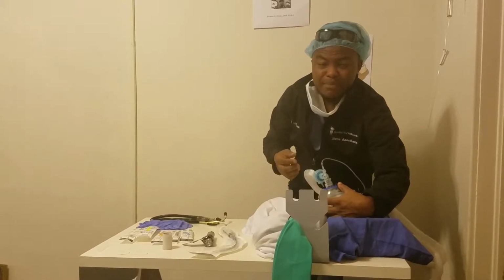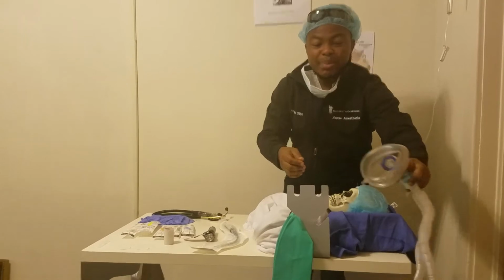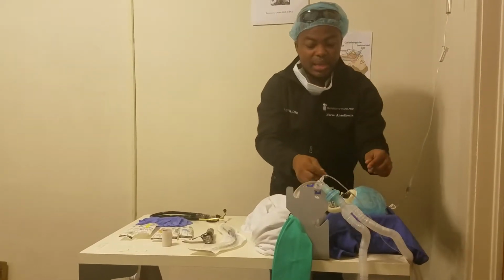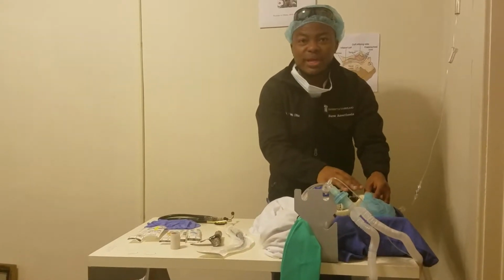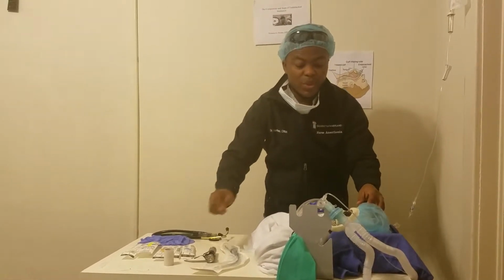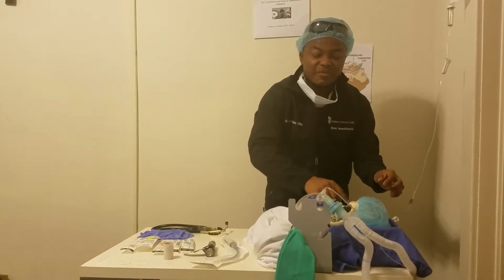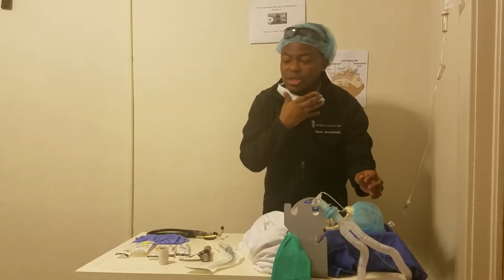Once we've done that and the patient is unconscious, we go ahead and apply either our tape at the start of our pre-oxygenation to prevent abrasion of the cornea. We can put some lubricant or use the Tegaderm. We check for lash reflexes. Once there's no lash reflex, that tells us that right here is an intubating condition.